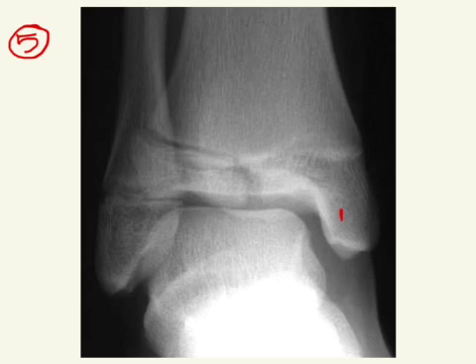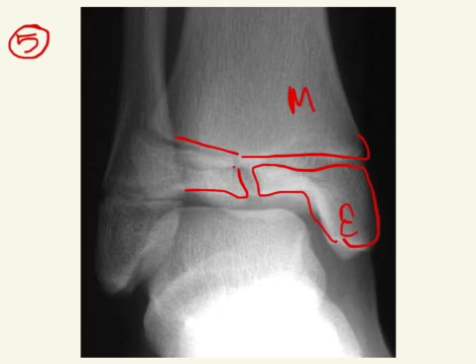This one is similar to the other one we saw — here is your epiphysis, here is your metaphysis, here is your physis, and you have a fracture through the epiphysis. And so this is below, so this is a Salter-Harris 3, and again notice that this is intra-articular.